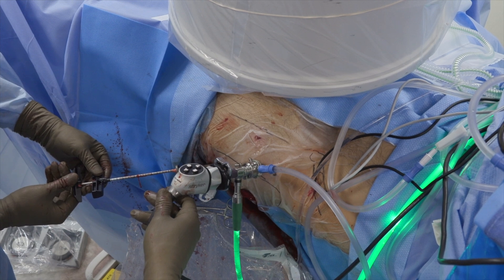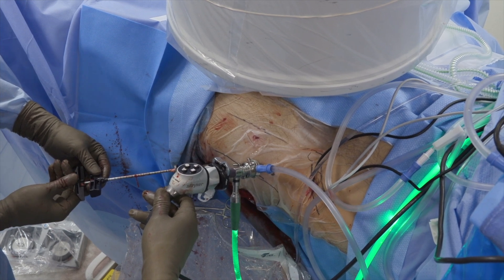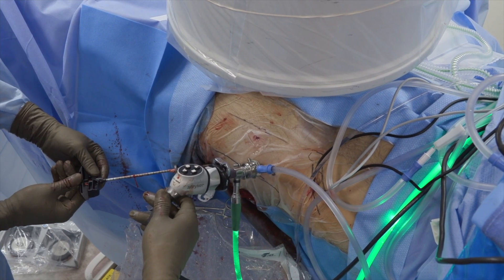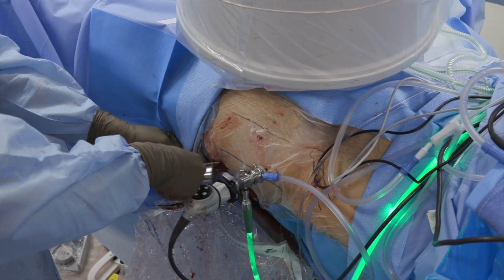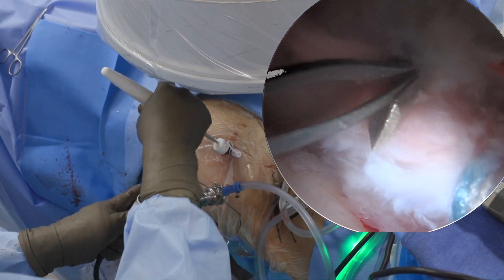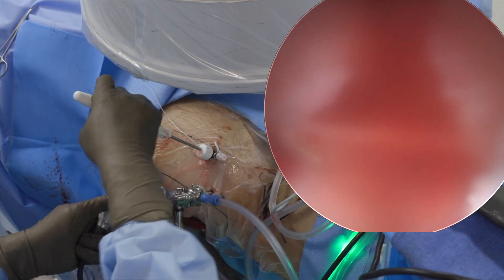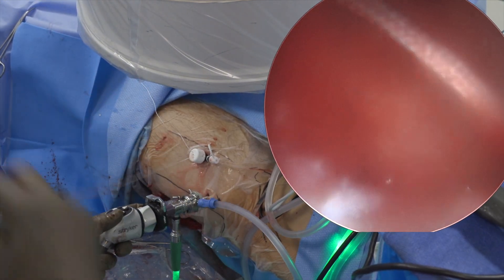Care should be taken to insert the stylet slowly since the pressure can damage the friable cartilage. The guide was then removed, and No. 2 suture was passed through the medial and lateral leaflets of the capsule and tied to complete the capsular imbrication.